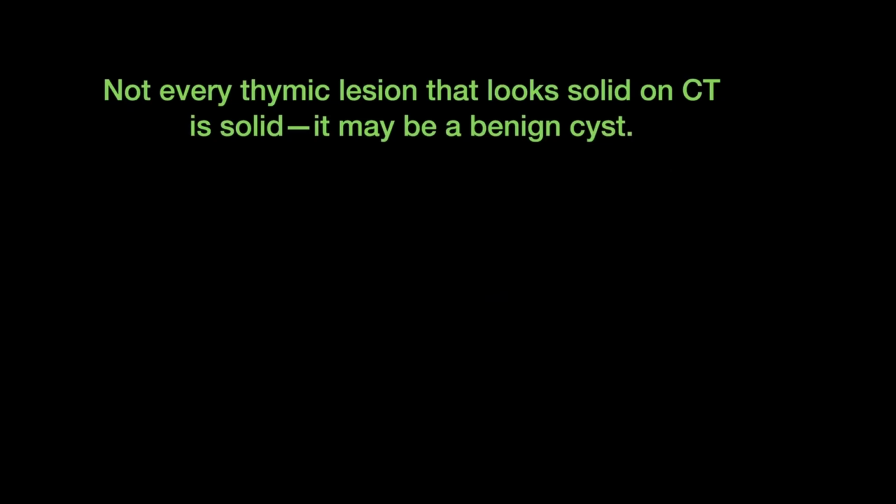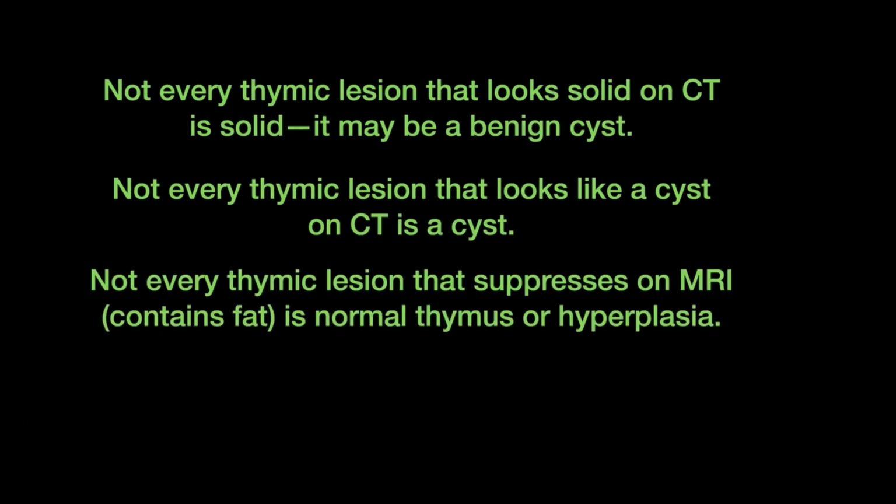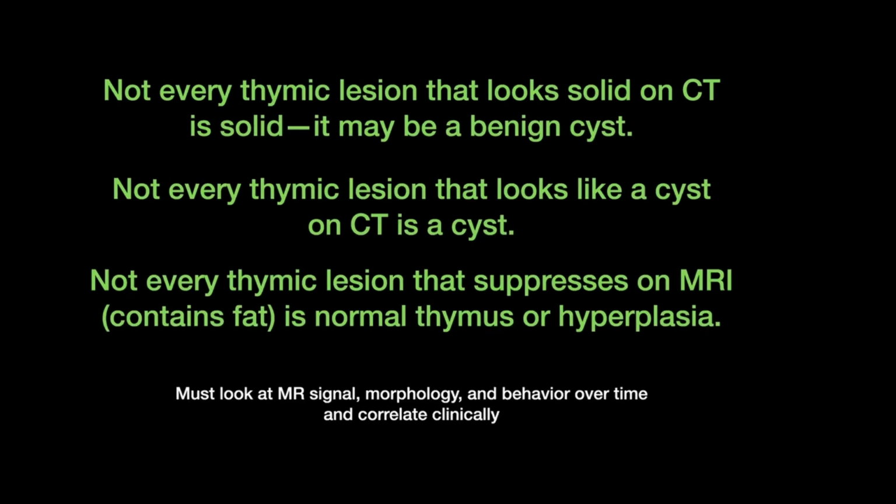So remember that not every thymic lesion that looks solid on CT is solid. It may be a benign cyst. Not every thymic lesion that looks like a cyst on CT is a cyst. And not every thymic lesion that suppresses on MR is normal thymus or hyperplasia. It might be a dermoid cyst, for example. So we have to look at the MR signal, the morphology, and behavior over time and correlate clinically before we make any decisions.